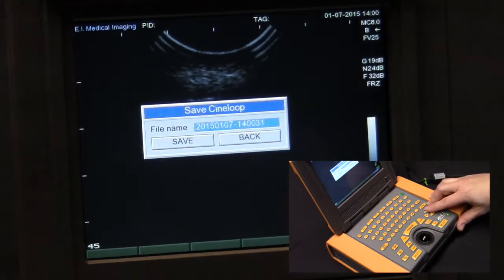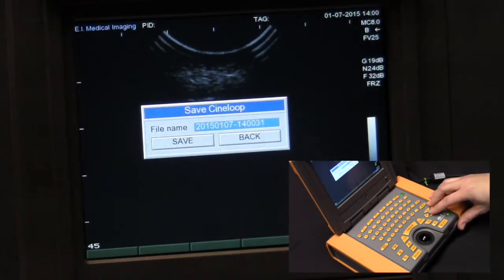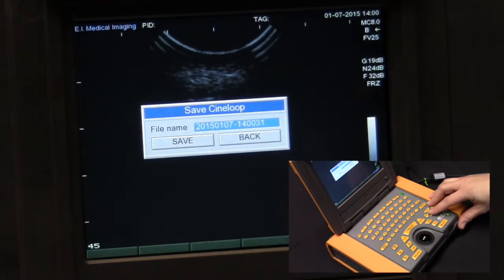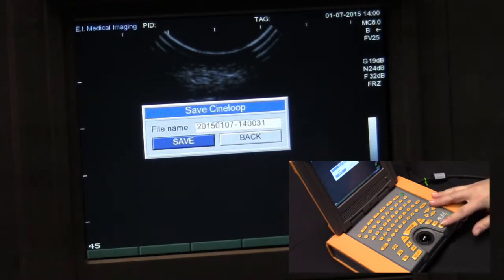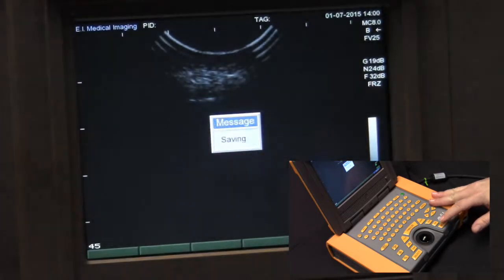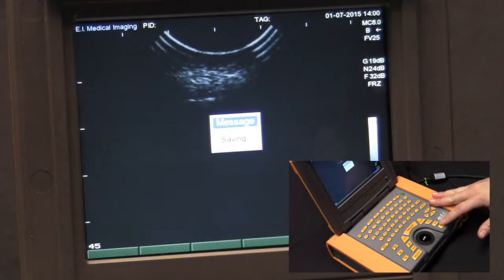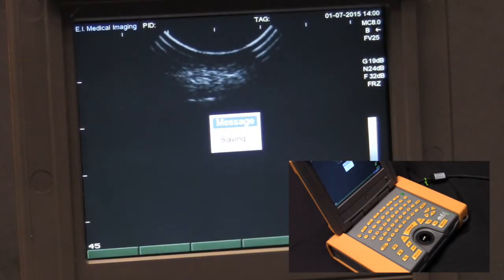You can highlight the default file name, which is a time date stamp, and type whatever you wish in that space. Or you can scroll down to save and press select to store the video loop.